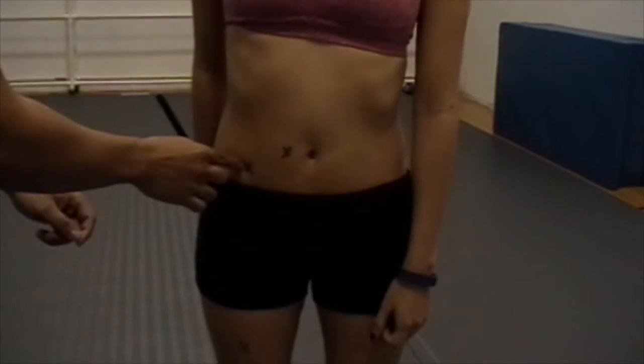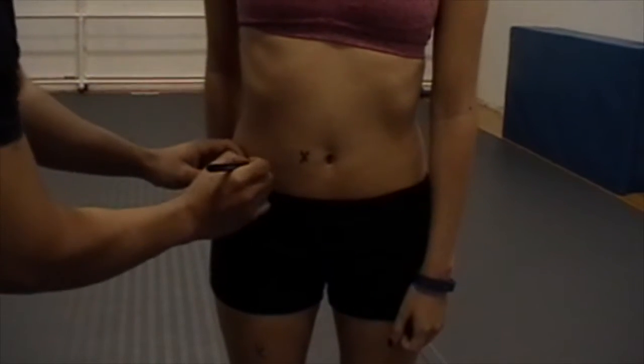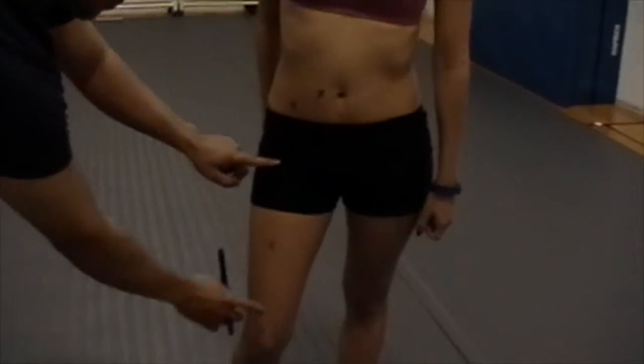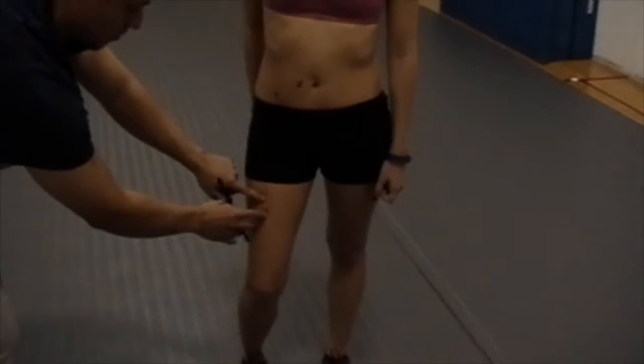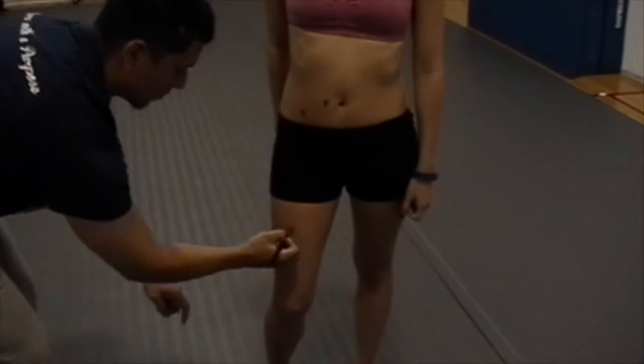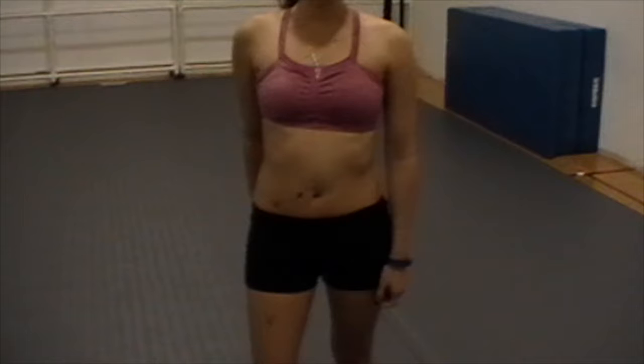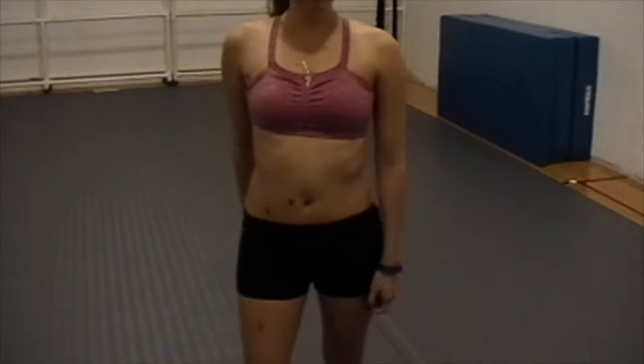Next is the suprailiac. It is a diagonal fold in line with the natural angle of the iliac crest, taken in the anterior axillary line immediately superior to the iliac crest. Next is the thigh. It is a vertical fold on the anterior midline of the thigh, midway between the proximal border of the patella and inguinal crest.